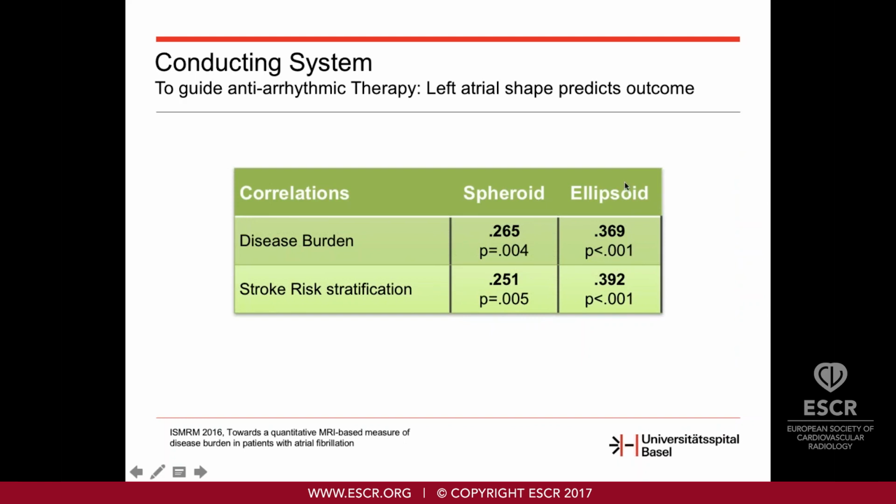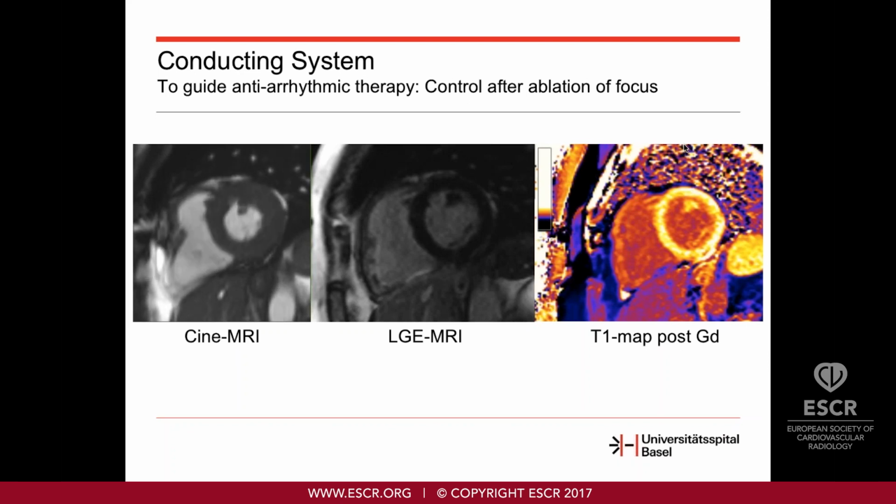Let me talk about this patient. This is a patient who has ventricular tachycardia, recurrent ventricular tachycardia, and for this he has a defibrillator. And our electrophysiologists were very interested to conduct imaging in these patients to identify a possible scar that might be the origin of this ventricular tachycardia. So for treatment planning, they asked us to do imaging, again, to identify a scar.